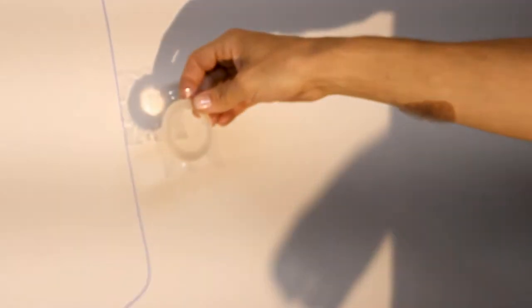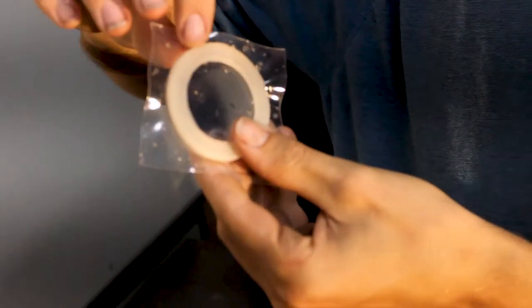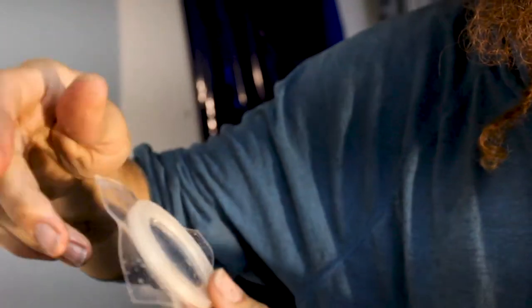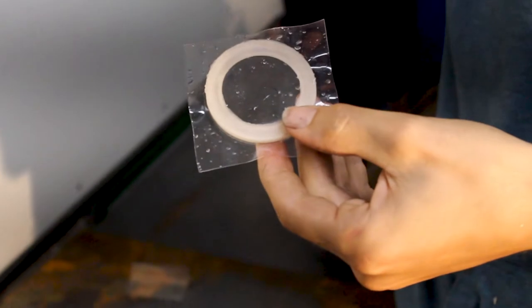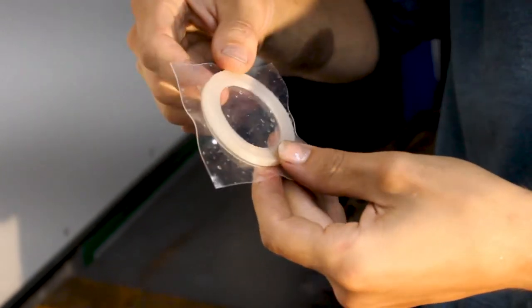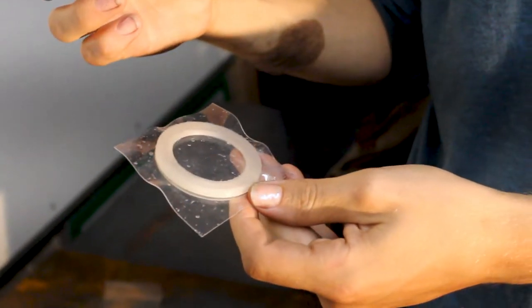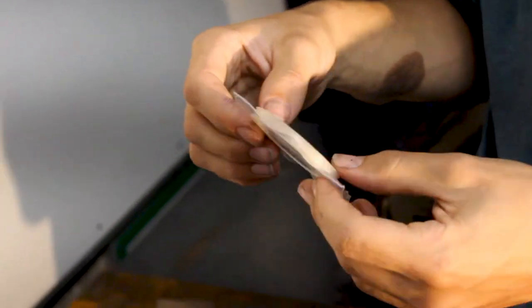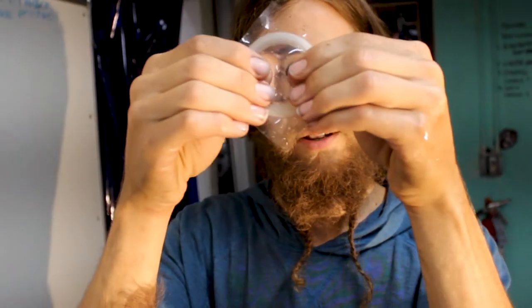So that should be a static lens. So this is one particular prescription lens. And that's defined by the thickness of that ring that I stuck on the inside. So I could pop this off, put a different size ring in there, and I would have a different prescription lens. So that's real. That's real.